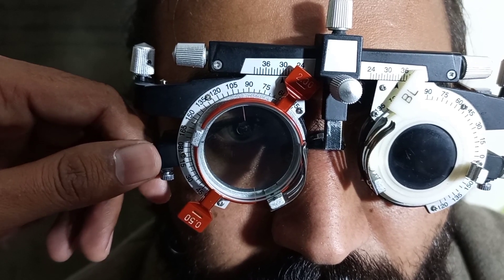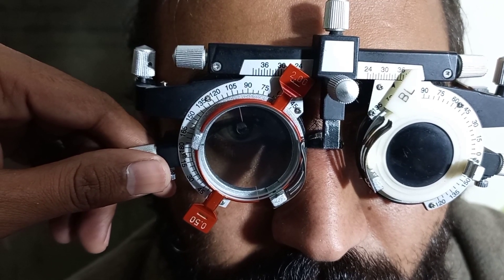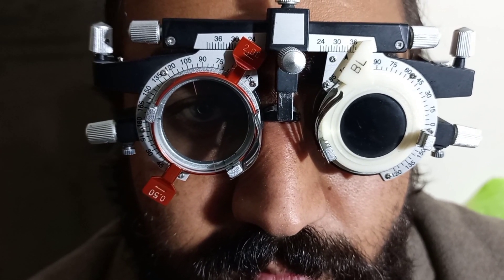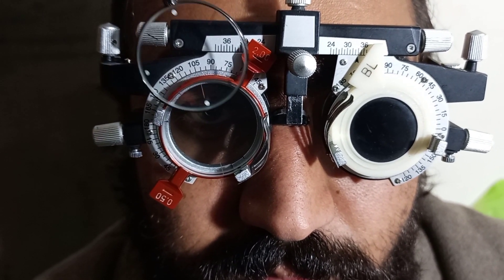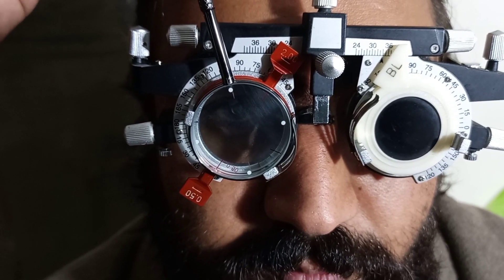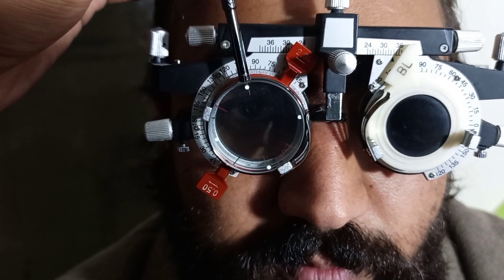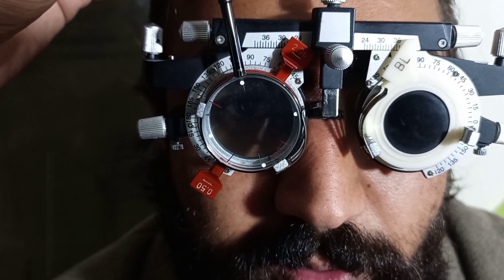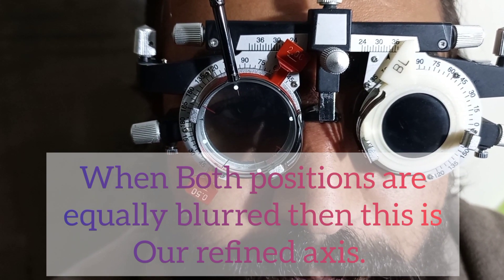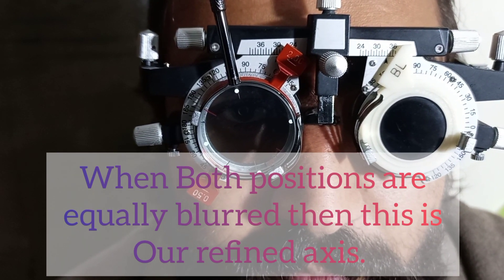Again we move our trial cylinder 5 degrees toward the preferred position. Our new axis is now 100 degrees. We align the handle of the Jackson Cross Cylinder at 100 degrees and ask the patient: position number one or position number two? The patient says both positions are equally blurred. This means 100 degrees is our final refined axis.